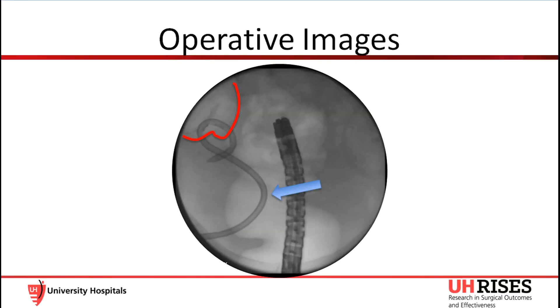We began by advancing our standard gastroscope per rectum into the rectal stump. There was obvious breakdown on the right side of the rectal stump. Note the extraluminal air outlined in red. A suture foreign body was also noted at this site. There was communication into an adjacent space presumed to be the pelvic abscess. The existing IR drain, shown with the blue arrow, appears to be in communication with the abscess.